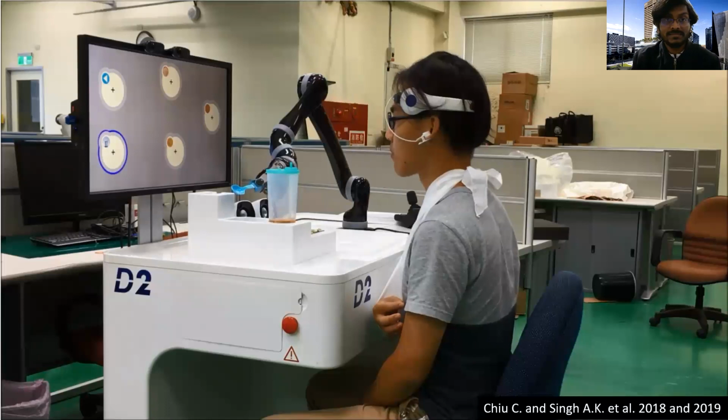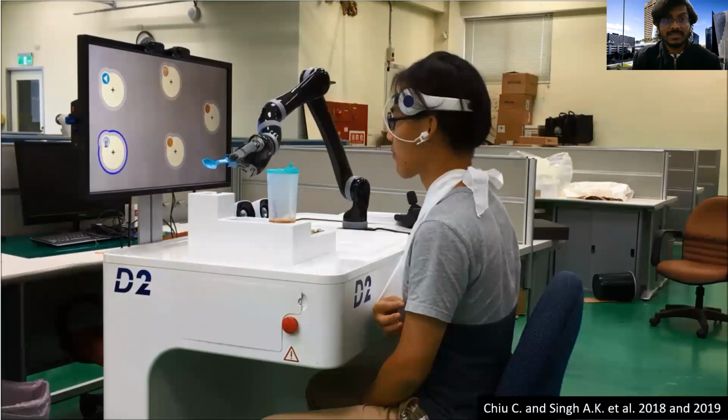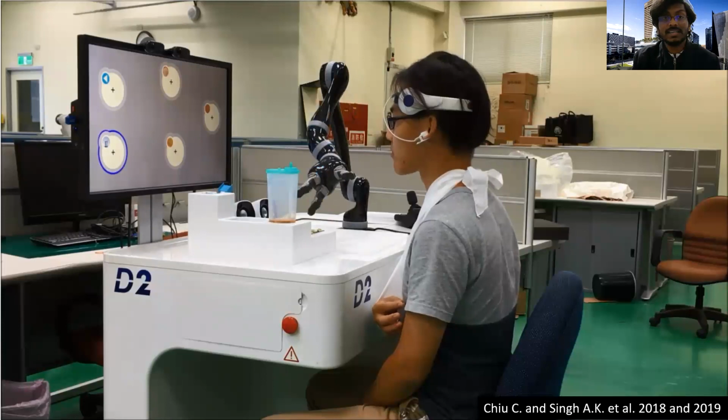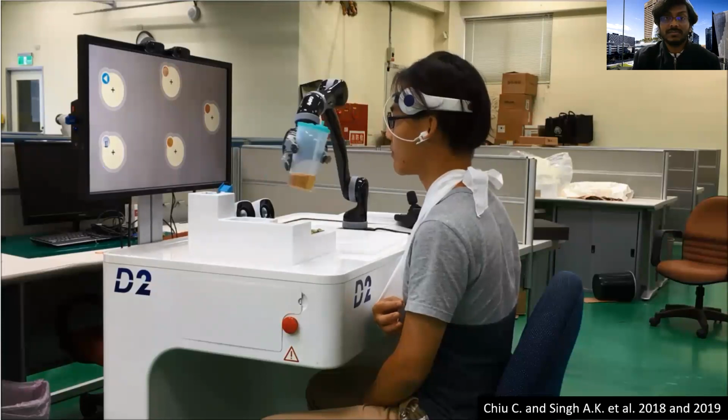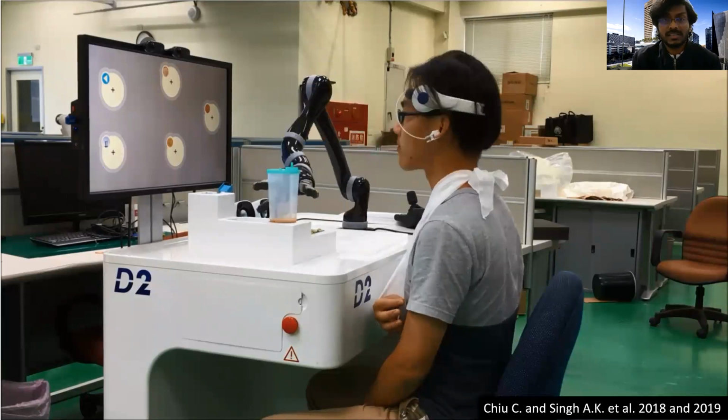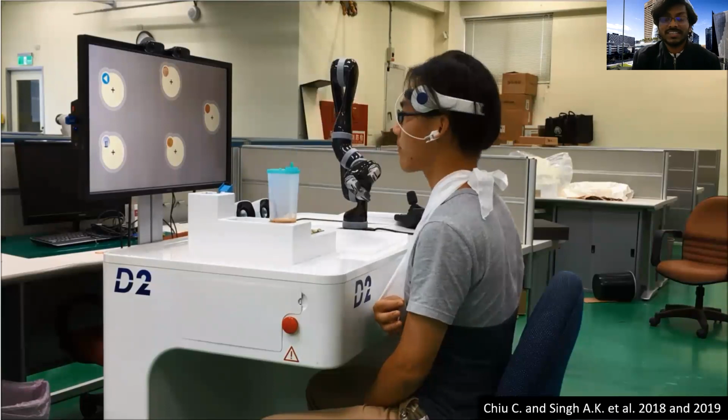And you see the user selected the water glass option, and the robotic arm, which is very precise, follows a defined arc of where to move and provides the user the option. This is just a demonstration. Of course, you will see the user could not even drink enough water, and the robot already pulled back the glass.